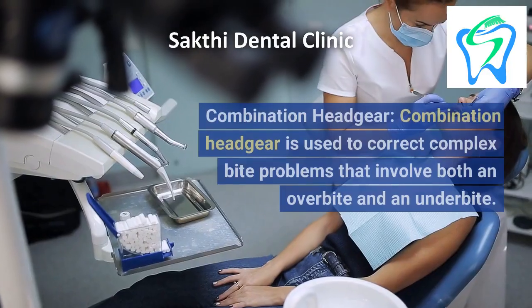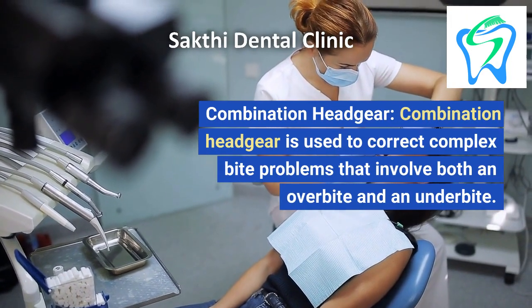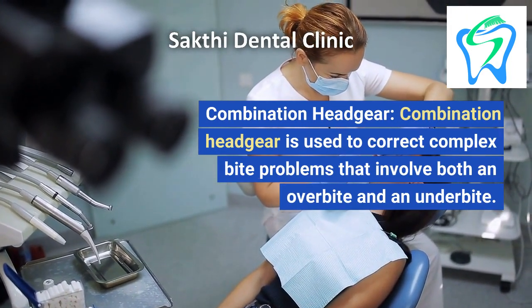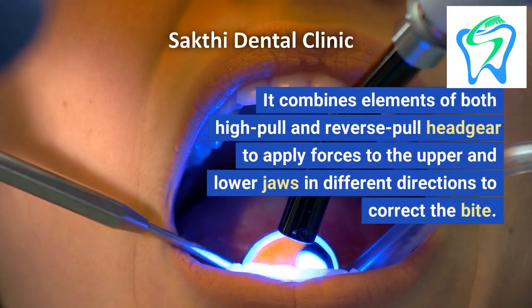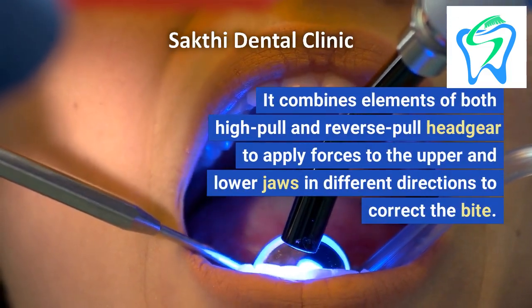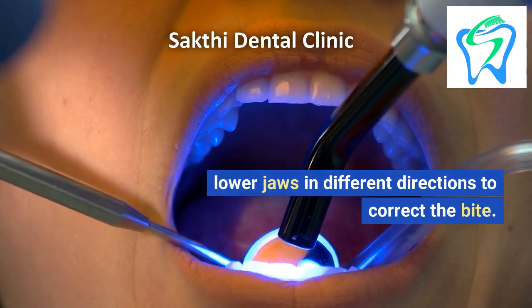4. Combination Headgear. Combination headgear is used to correct complex bite problems that involve both an overbite and an underbite. It combines elements of both high pull and reverse pull headgear to apply forces to the upper and lower jaws in different directions to correct the bite.